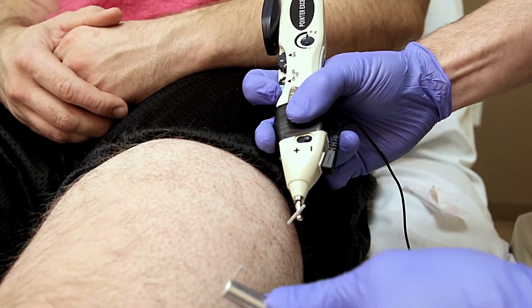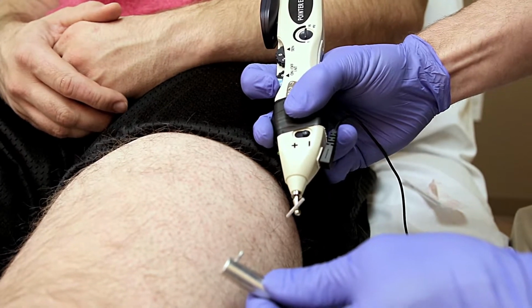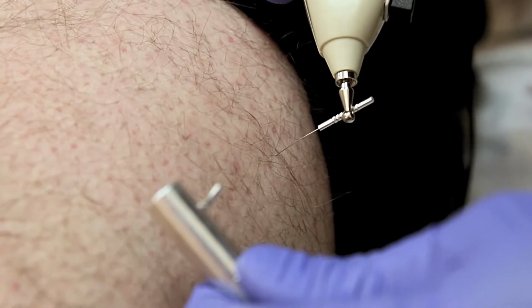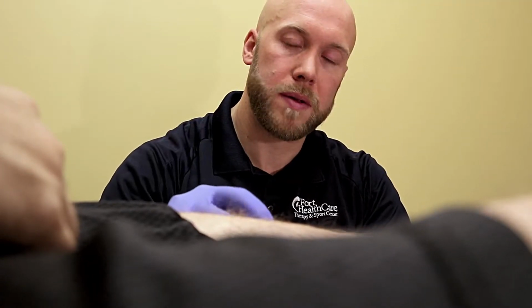The treatment will vary based on the patient, so we're going to identify the most active and most irritable spots, and we're going to try to get those ones first. We can elicit that local twitch response through the needle hitting the tissue, or once the needle's in, we can hit it with some E-stim, and you'll feel a gentle pulse in the tissue.